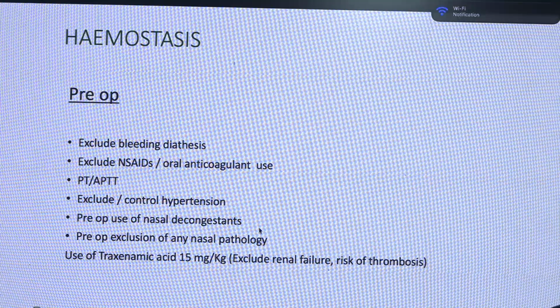The ENT surgeons really show us the way. We don't do that much. They use almost 3 ampules of adrenaline in the pack, make it of course dry, and then do the nasal packing. We don't use that much.